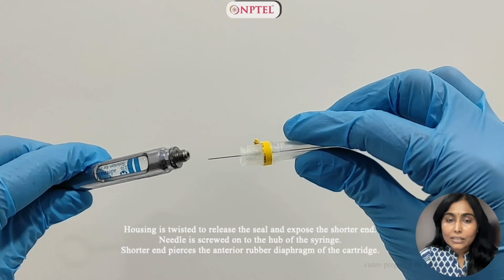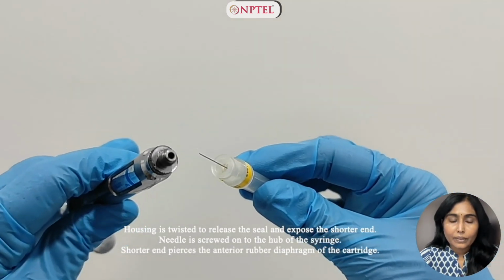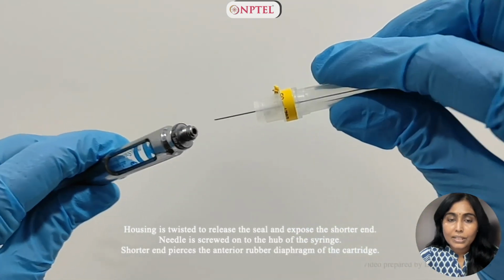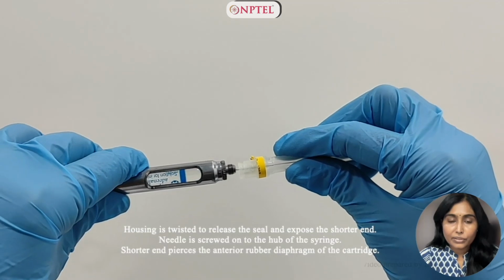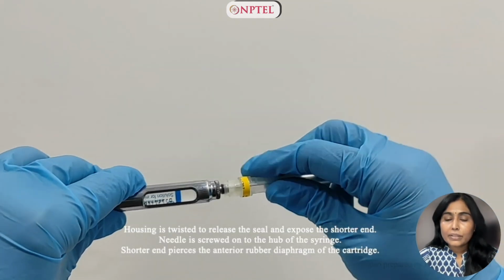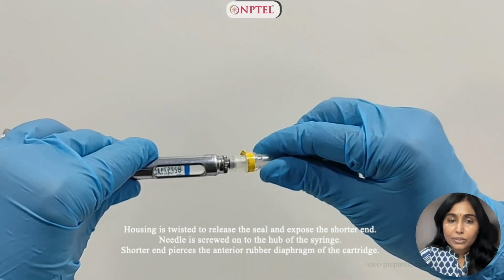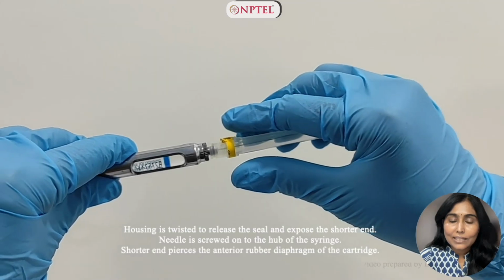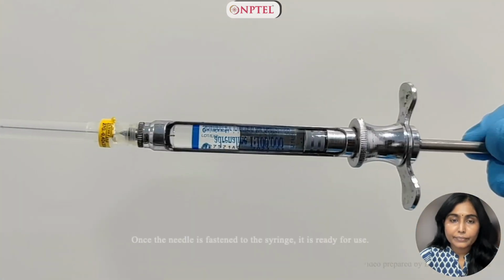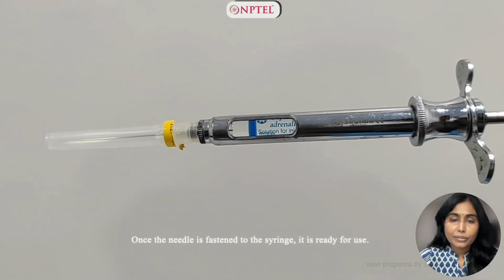Now the needle is screwed on to the hub of the syringe. Notice that the shorter end is screwed on to the hub of the syringe. This pierces the anterior rubber diaphragm of the cartridge. With gentle twisting motion, you secure the needle to the syringe. Once the needle is fastened to the syringe, you're ready to go.